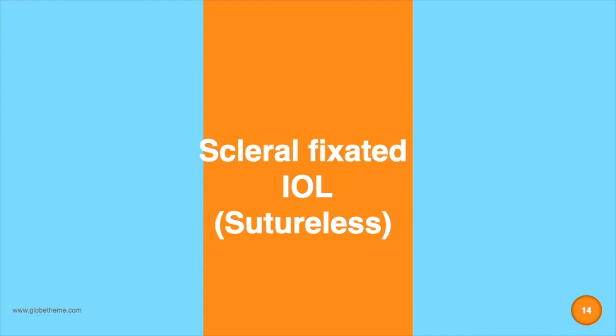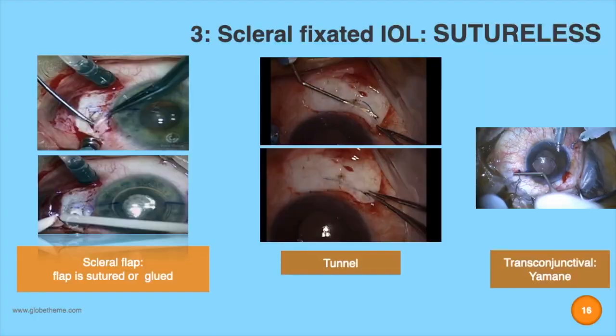Now, let's go to the latest technique of scleral fixated IOL, the sutureless implantation. We will be using the 3-piece foldable IOL. Basically, there are two important issues pertaining to this technique. Firstly, is how to externalize the haptic through the sclerostomy wound.